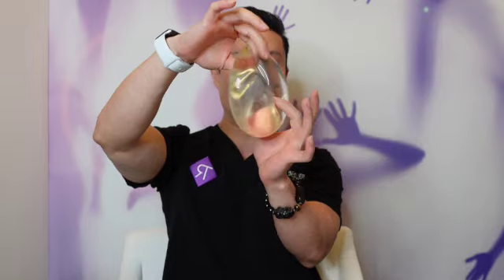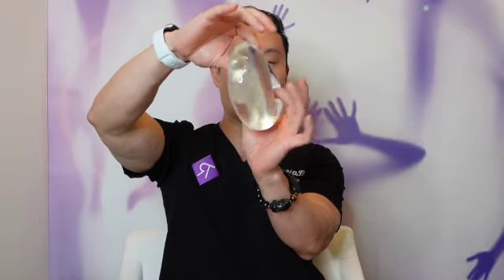The vast majority of patients do stick with the moderate profile implant. You can see it's a thicker implant. It does provide more projection, but it also gives you a continued softer, more natural look. Now the high profile implant, you can see it really projects a lot, very thick. These implants tend to project more.